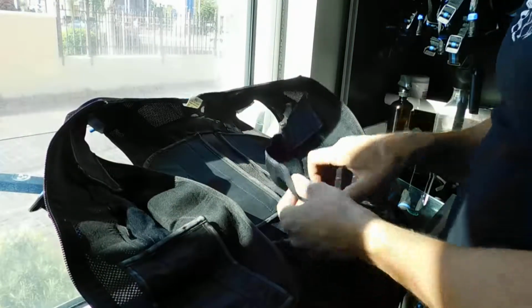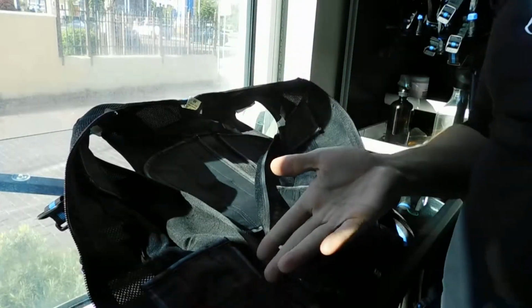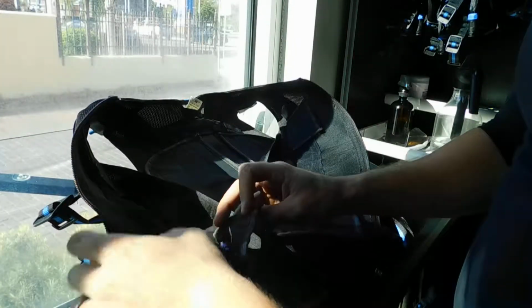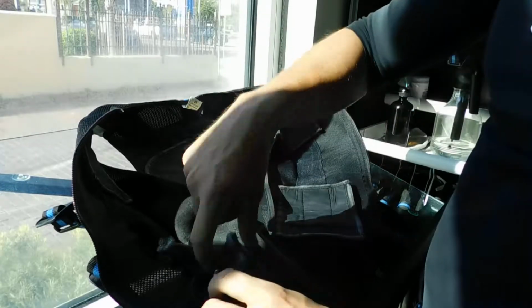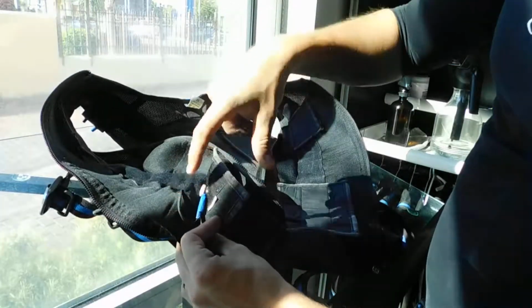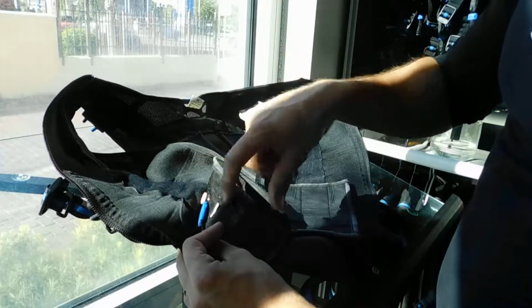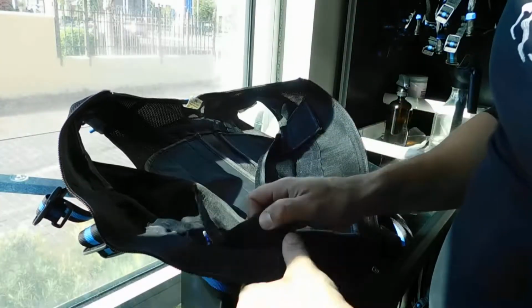So you can fix that easily by doing this, for example. Carefully lift these up and straighten it out. And now it's basically good to go. But because of that, lots of times, this cable right here needs to be facing up, by the way. And it has to be in a perfect form with no pressure on the actual cable itself. Otherwise it breaks. So it's very important that it's actually like that.